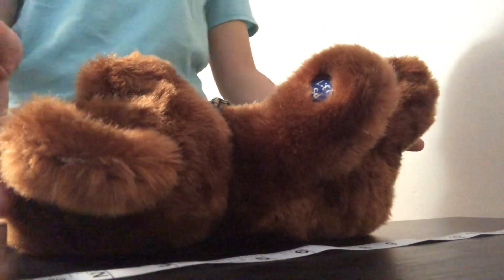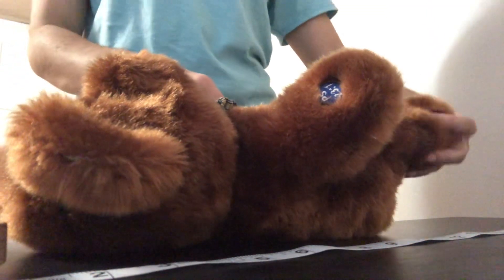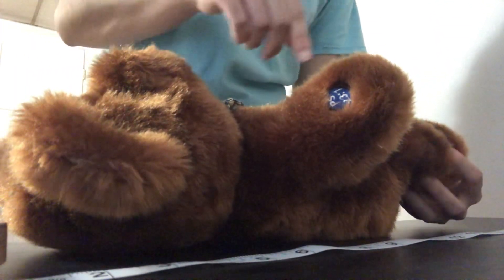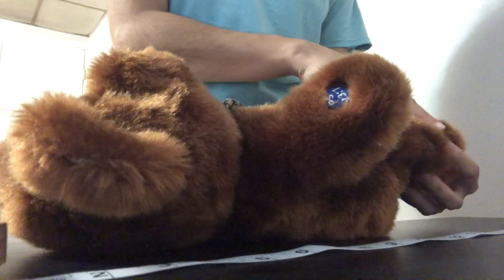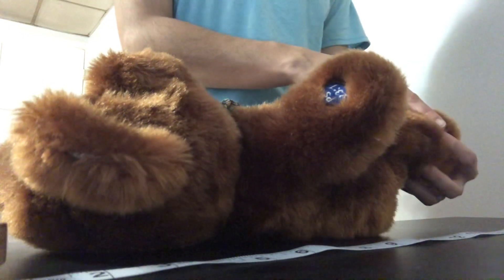So let's say, which is right here. I am then going to straighten the back and the legs. I'm going to tape the small leg and straighten it. And then I'm going to read the mark of the measurement tape, which could be in inches or centimeters.